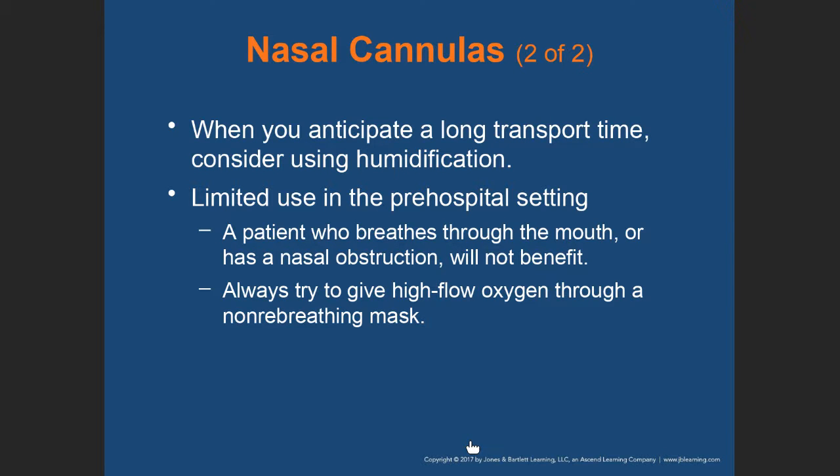So the humidifier is necessary for long transport times. Patients with upper or lower respiratory tract infection that requires oxygen, and patients with airway burns. We do not use the humidifier in the field. We use dry oxygen in the field, and then we use the humidifier on the unit.